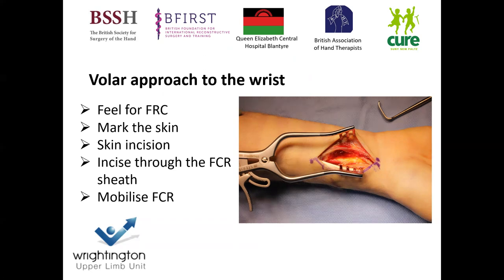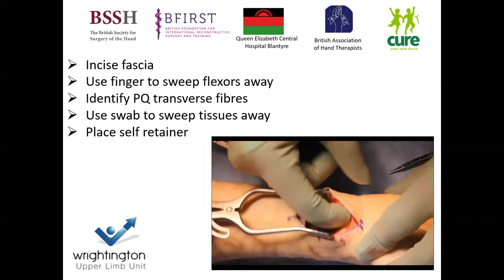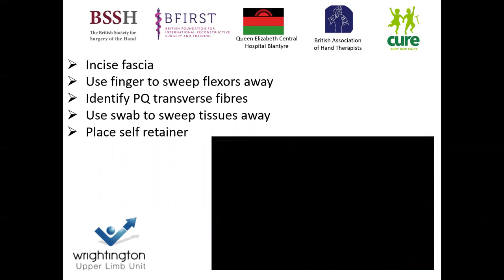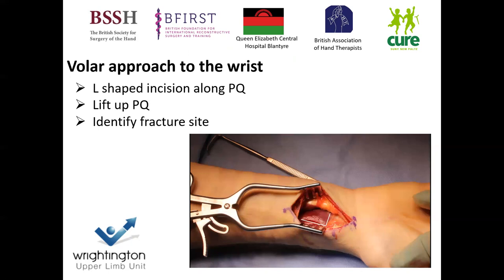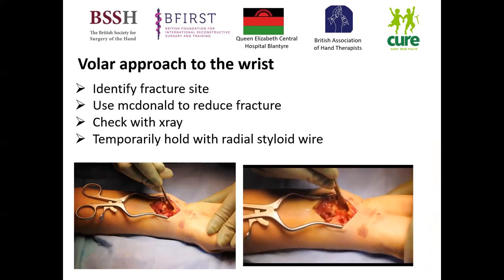If you take the FCR ulnarly, you need to be aware of the radial artery on the radial side. Once we go through the skin incision, we sweep our finger across and you can see we're coming down to the pronator quadratus at the bottom, identifiable from its transverse fibers. I use my finger to sweep away the tissues and a self-retainer to aid exposure of PQ. I then do an L-shaped incision along the radial border of PQ and along the distal portion through the muscle fibers, deliberately preserving the distal wrist ligaments, allowing reflection of the tissue to expose the distal radius fracture.